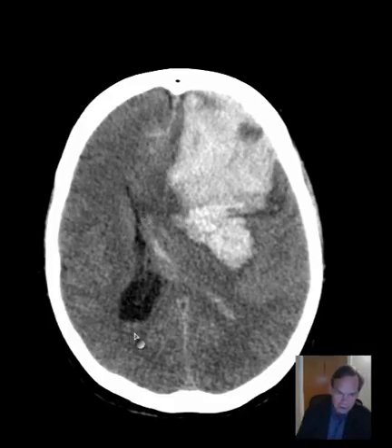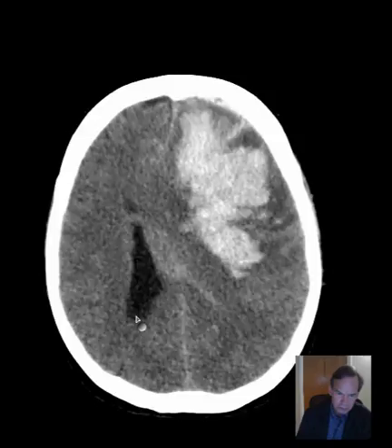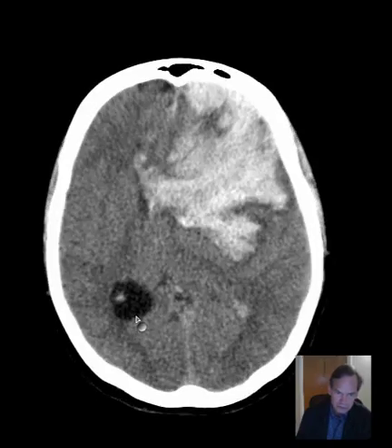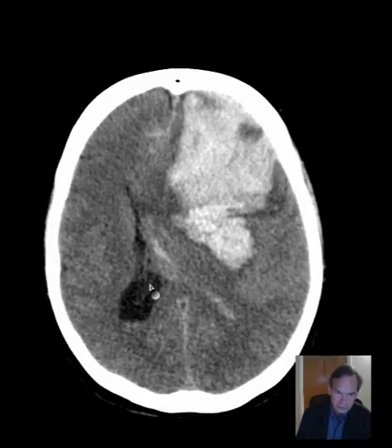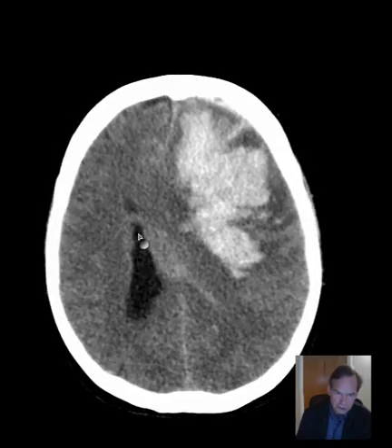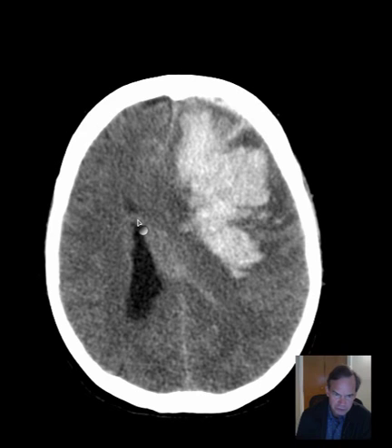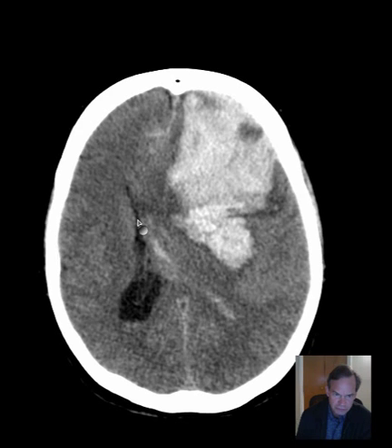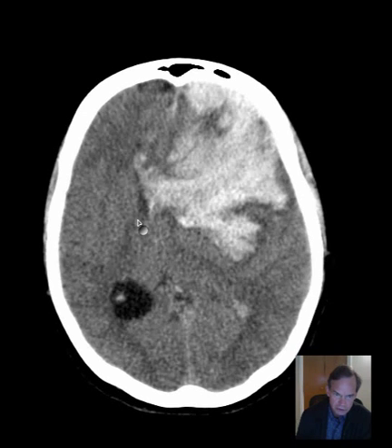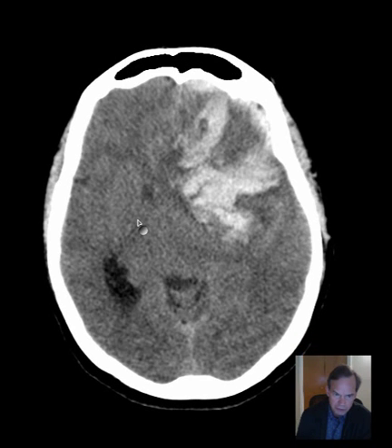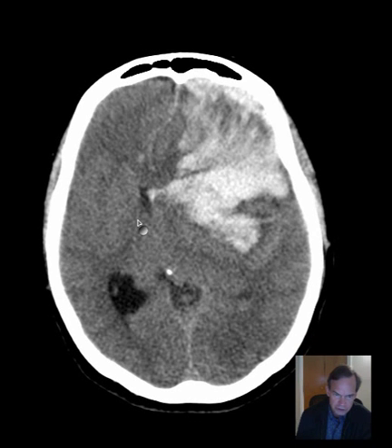You can see a small amount of blood in the lateral ventricle. I'm going to guess one, two and a half, three centimeters of midline shift, which is a huge amount of midline shift.